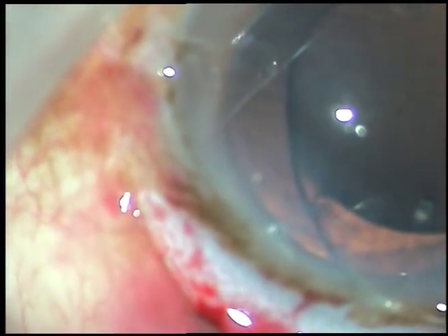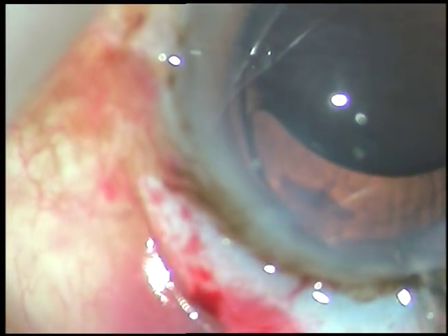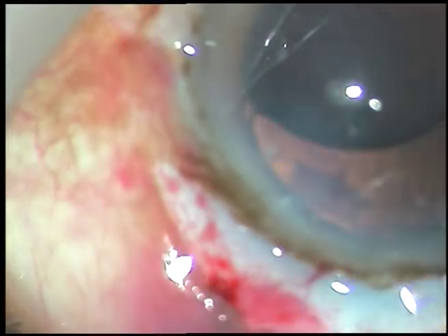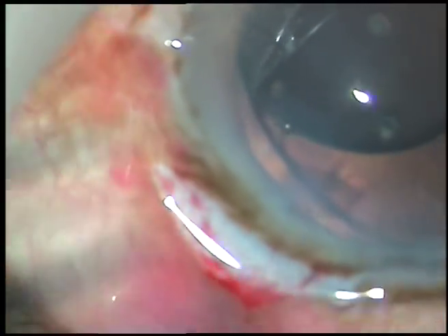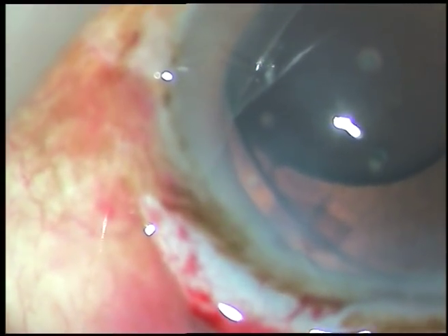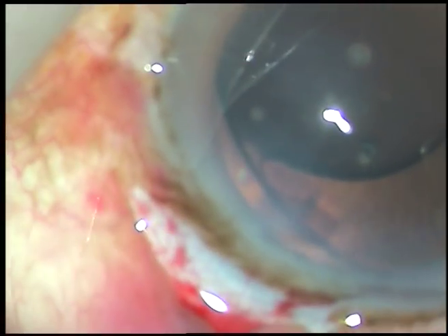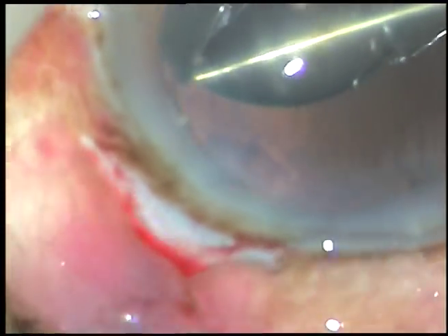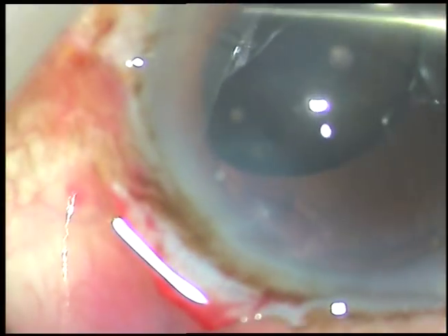The size of the rhexis was about 5.5mm, and this 6mm optic size will sit over the anterior capsular rim very well. Here the trailing haptic was not going into the sulcus, so I go through the side port with the Sinskey hook and dial it in the sulcus.